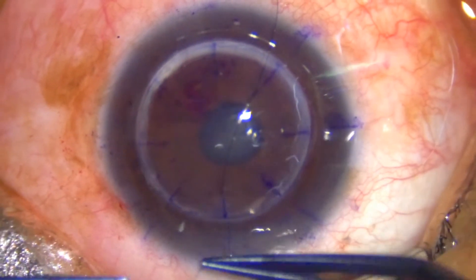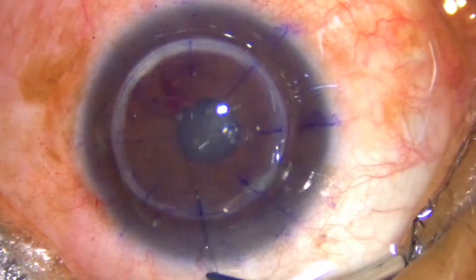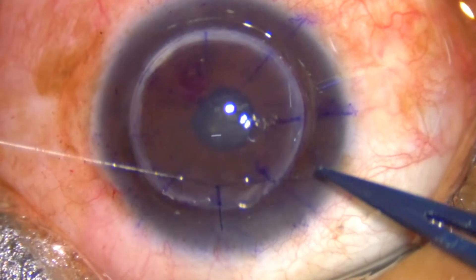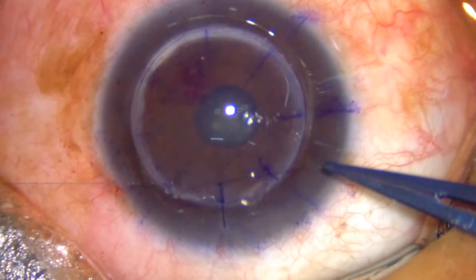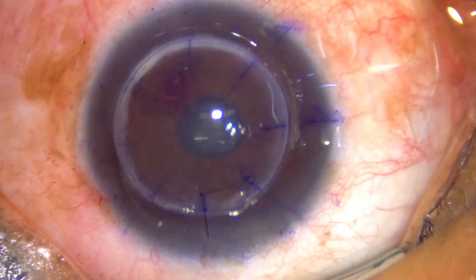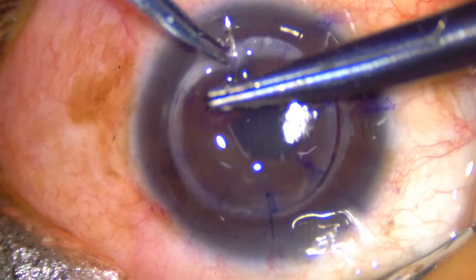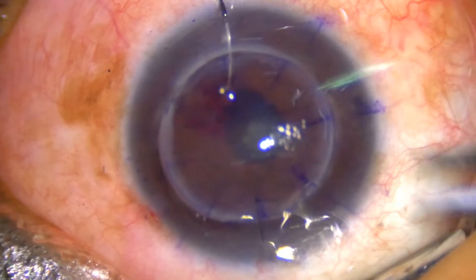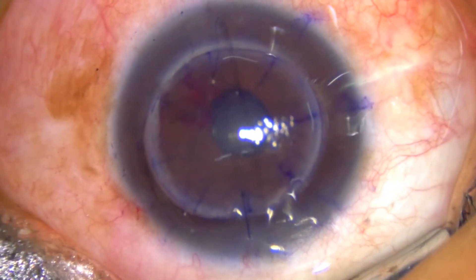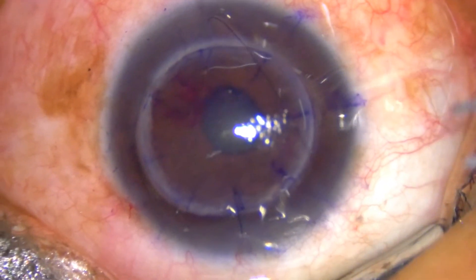I usually complete first 12 o'clock, then 6 o'clock, then 3 o'clock, and then 9 o'clock sutures. Once these four sutures are taken, the anterior chamber is usually formed. If your graft size and the host size are correct, taking sutures with patience is very important. All sutures are taken at nearly 80 to 90 percent of depth.